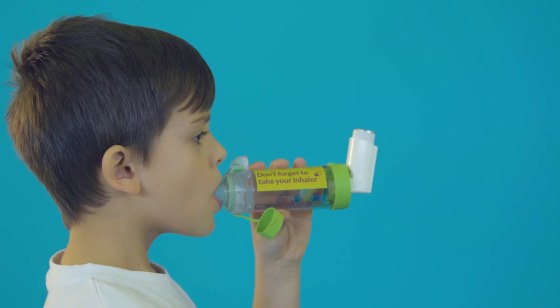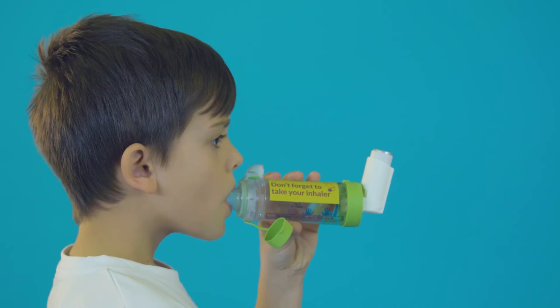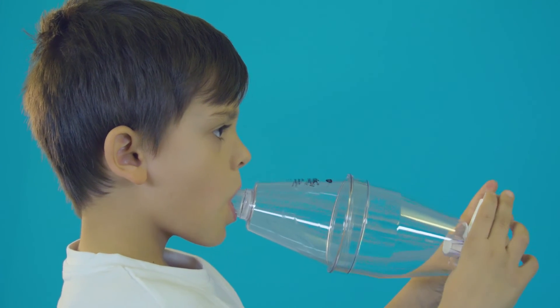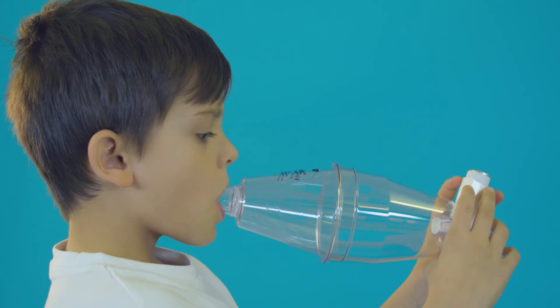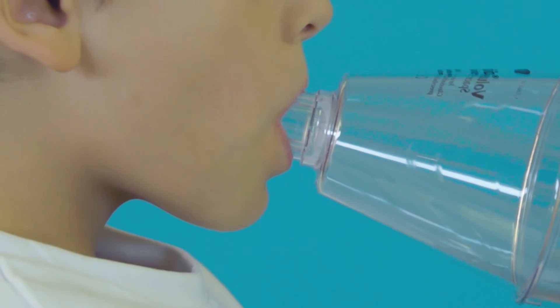If your child is using a small volume spacer, some of them make a whistling sound if they are breathing in too fast. If they're using a large volume spacer like this one, the breathing techniques are the same. With tidal breathing, the spacer should make a clicking sound as they breathe in and out.